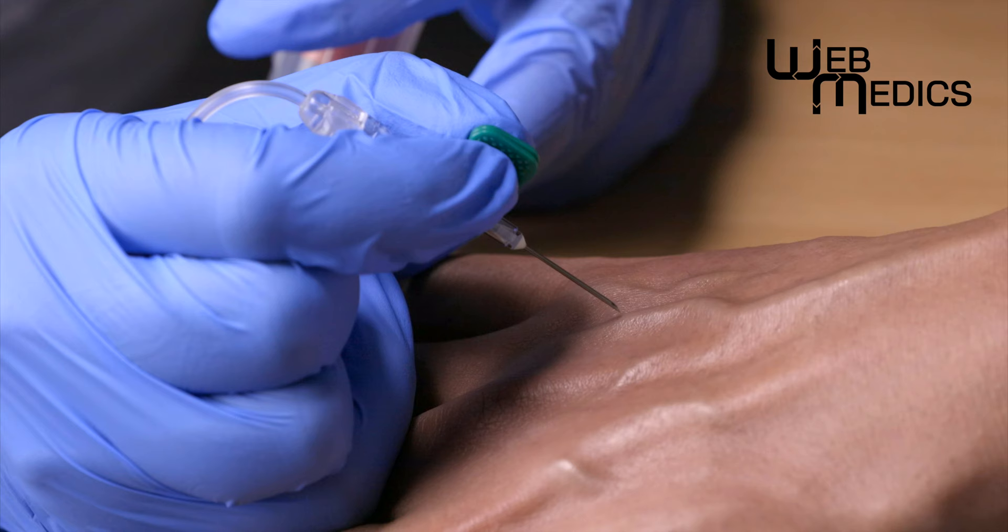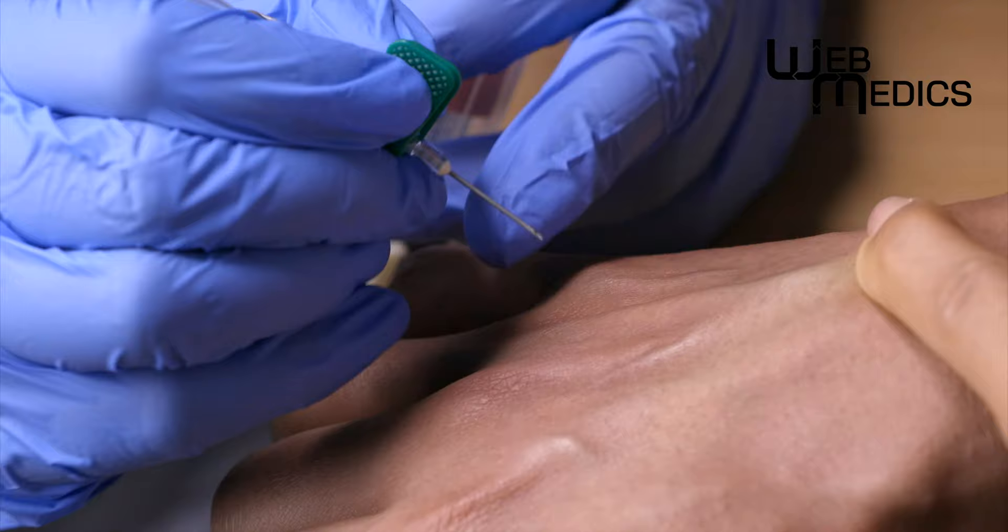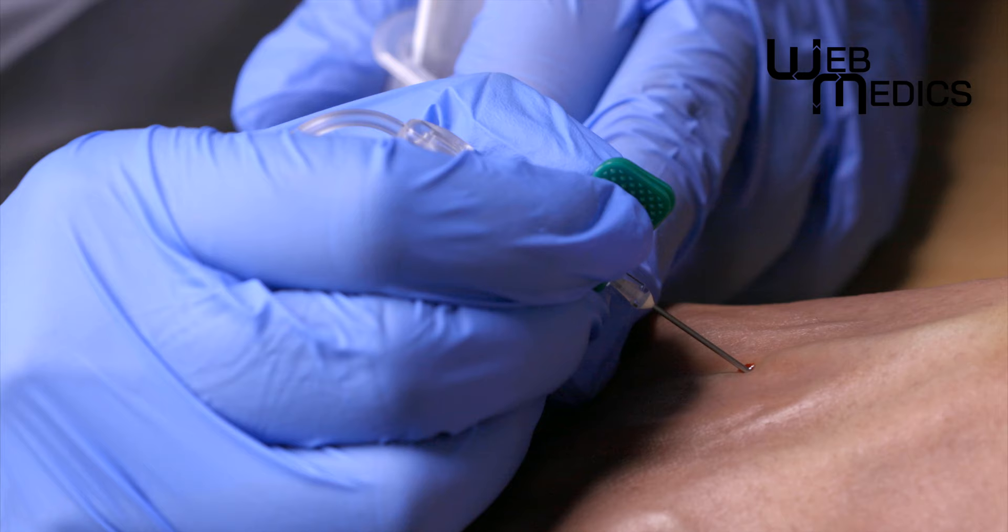Here, my wife deliberately demonstrates the wrong position and wrong angle, causing a failed attempt and quite a bit of pain. When she follows position, angle and maneuver, she succeeds without even trying, and I hardly felt anything.